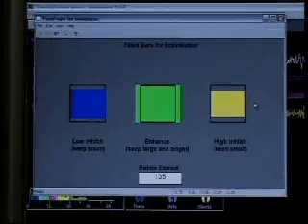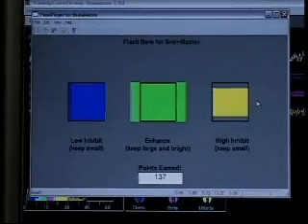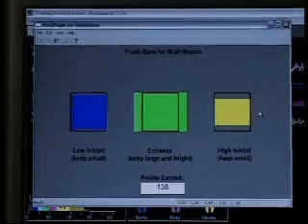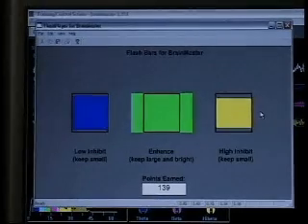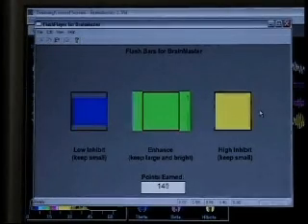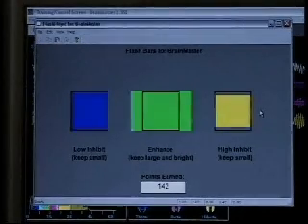This is a neat little training game. The goal for Inhibits is to keep the box or the color small and enhanced to make it large and bright.